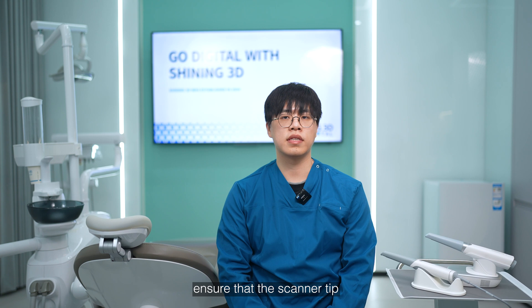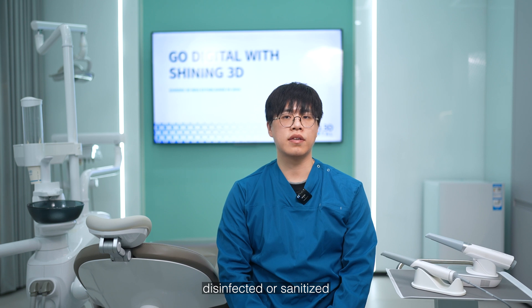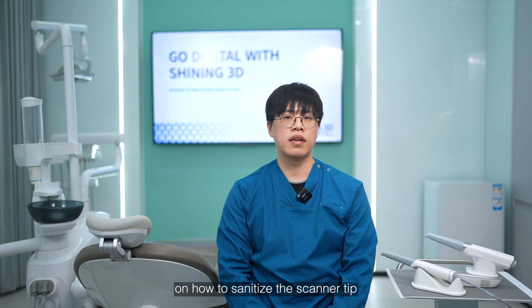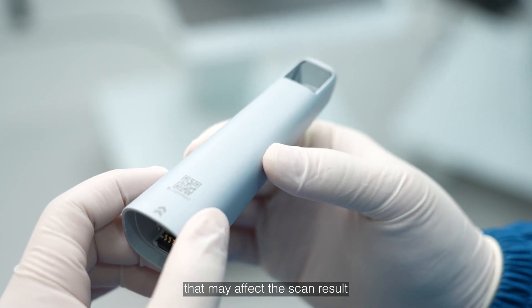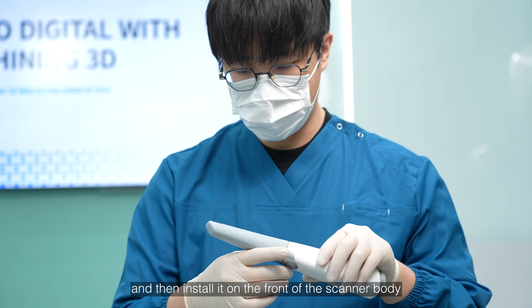Second, ensure that the scanner tip, body, and cradle are properly cleaned, disinfected, or sanitized. You can find more details on how to sanitize the scanner tip in another video. Check the scanner tip for any damages or scratches that may affect the scanning result, and then install it on the front of the scanner body.